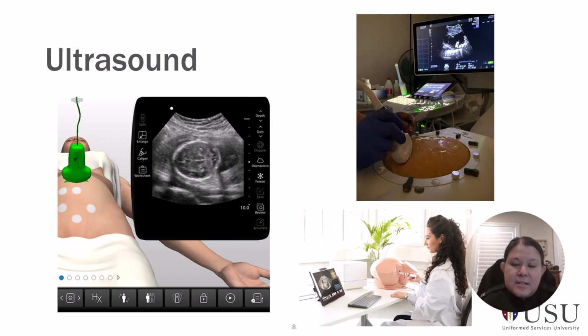The other nice thing is it does include some educational things like background, how to scan, different anatomy that can be correlated with the training sessions. So a really great option. Probably not quite the same hand feel as what is shown over here on the upper right, which is another simulator that allows you to actually scan on a model with different parts on the inside. So that can give you a little bit more of a hand sweep because you're kind of going over the entire abdomen in that simulated model.